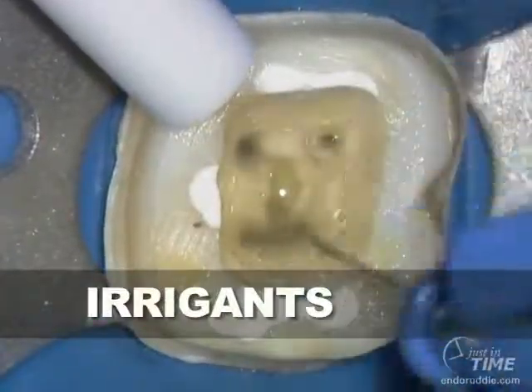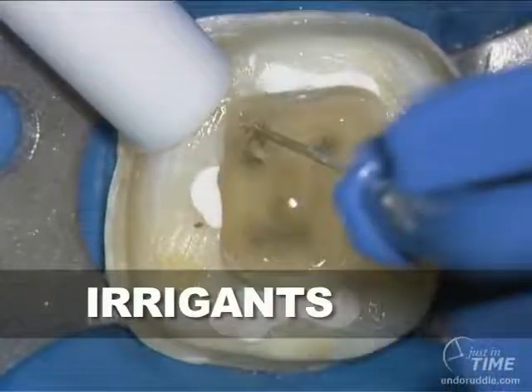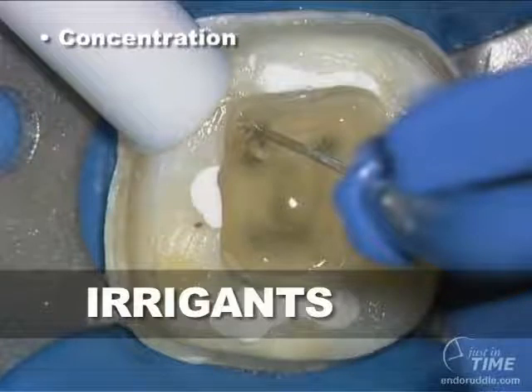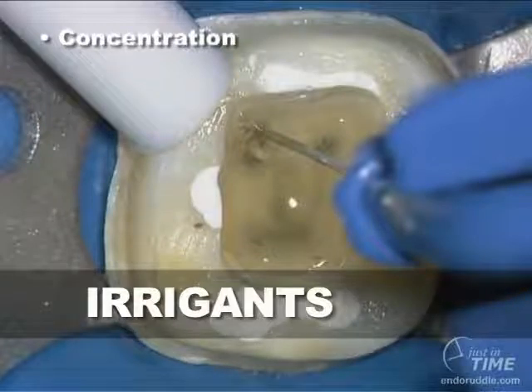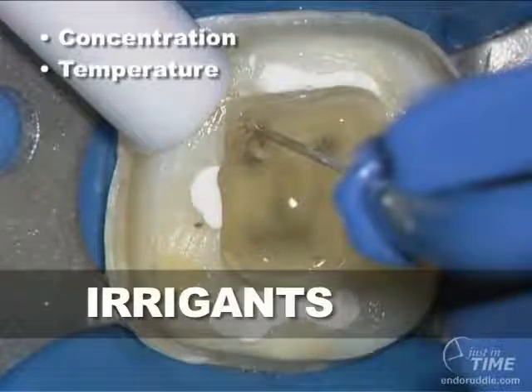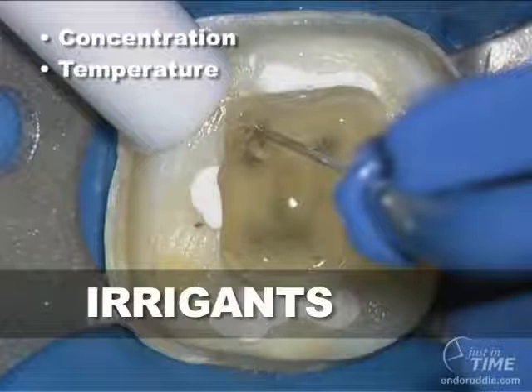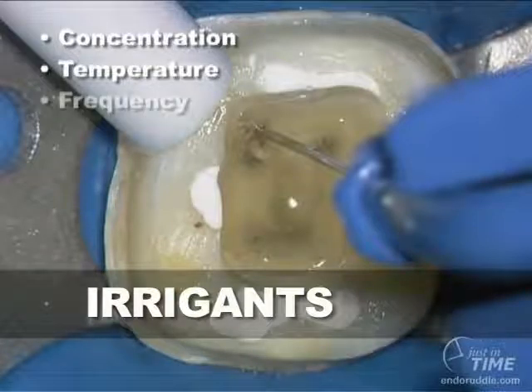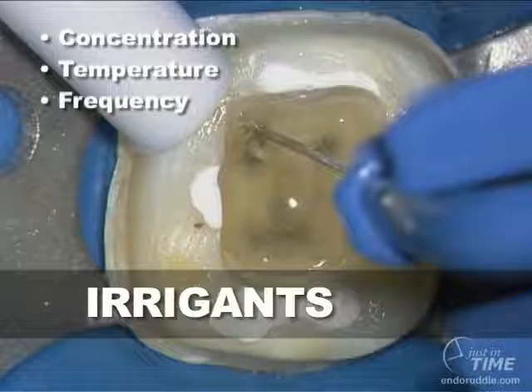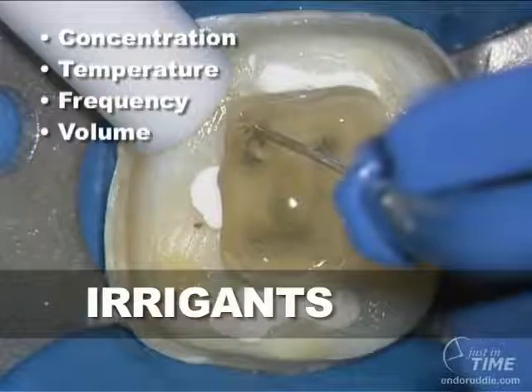The irrigants we use will directly affect our ability to disinfect and clean root canal systems. 6% sodium hypochlorite has been found to be the ideal concentration to allow us to debride. If we increase the temperature of sodium hypochlorite to 60 degrees centigrade, we'll reduce our digestion times from about 28 minutes to 12 and a half minutes. The frequency that we replenish reagent into the pulp chamber will also influence disinfection, as will the volume dispensed each time we irrigate.